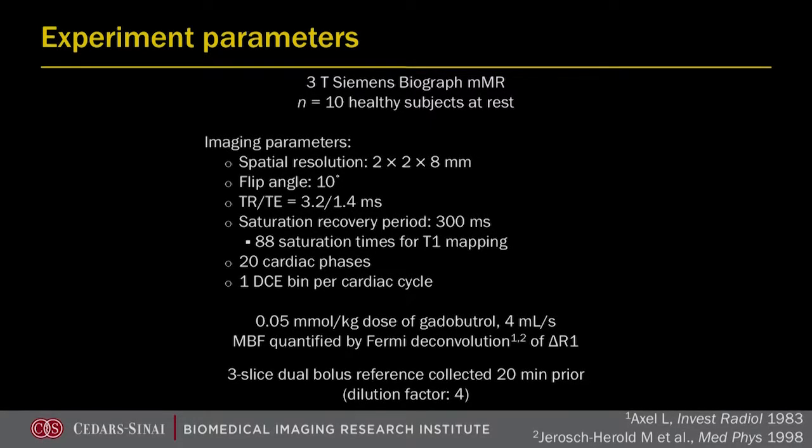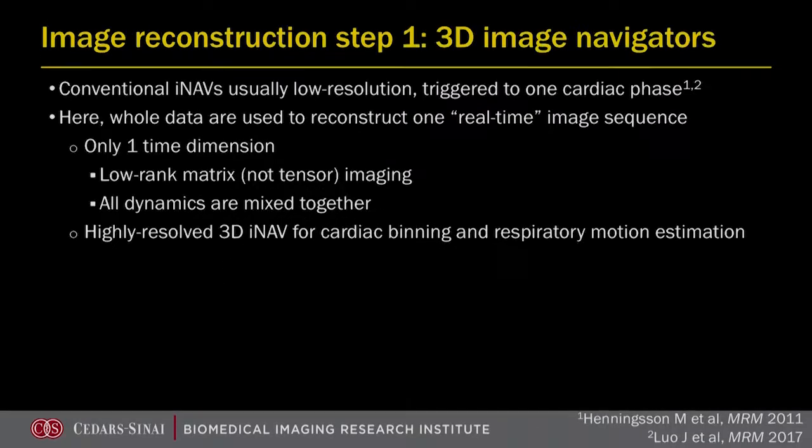We did our MBF, myocardial blood flow, quantification by Fermi deconvolution of our delta R1 after mapping. And we also collected a 3-slice dual bolus reference 20 minutes prior to the multitasking.